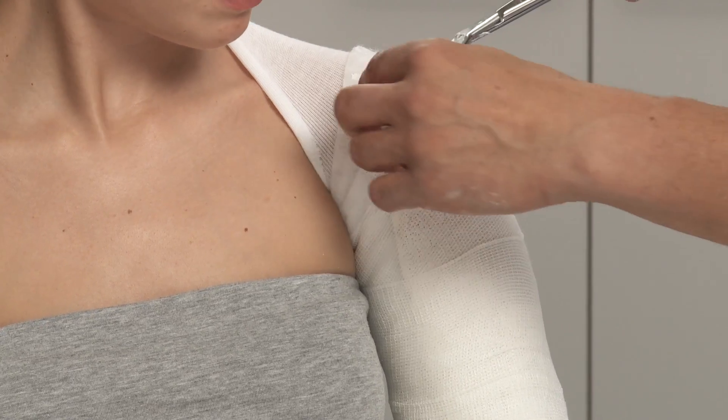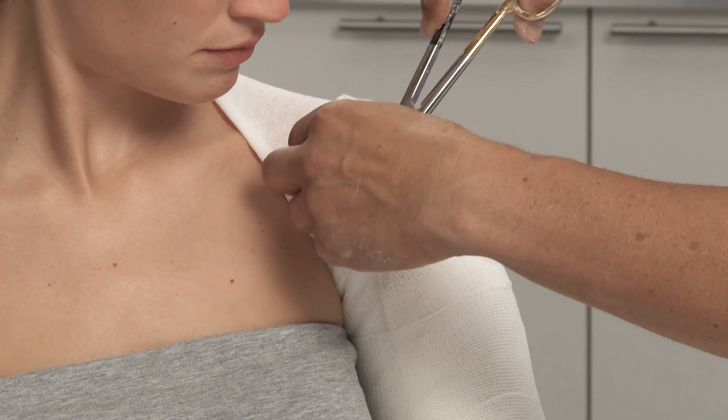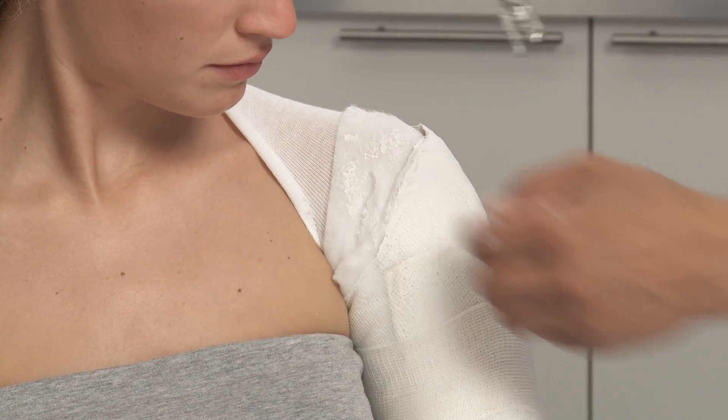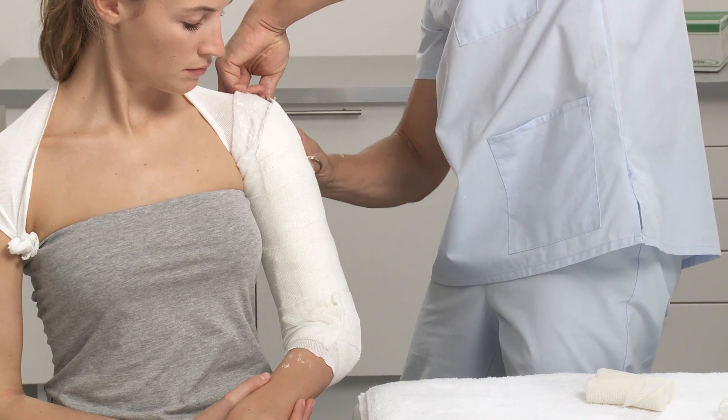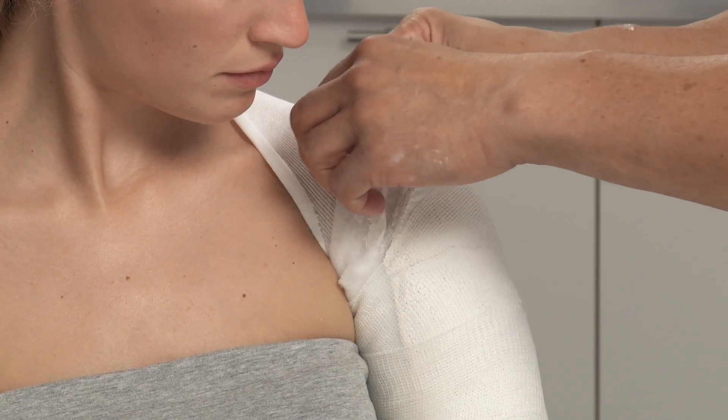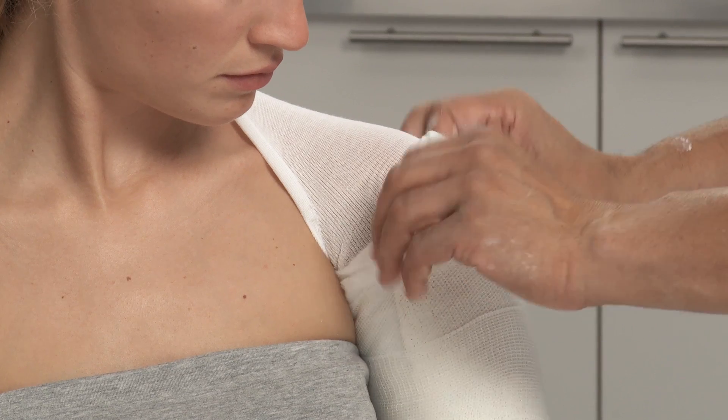Cut away any surplus splint. Fold back the padding at the proximal end of the arm.